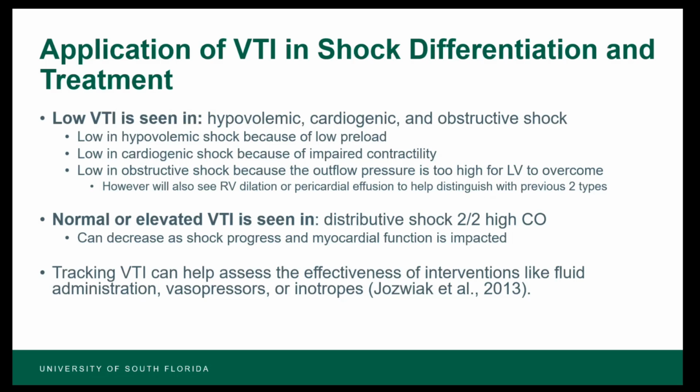So in terms of applying the VTI in the state of shock, let's say the context is our patient is stable-ish on pressors. We have our patient on multiple pressors in the ICU, but we can't exactly tell what is requiring this patient to be on pressors. We can't tell what kind of shock this is. So one of the easier ways to elucidate that, before we get an official, further reading of echoes and other laboratory tests, is we can go to the bedside, place a probe on our patient, and see what we're doing to our patient actively in real time.